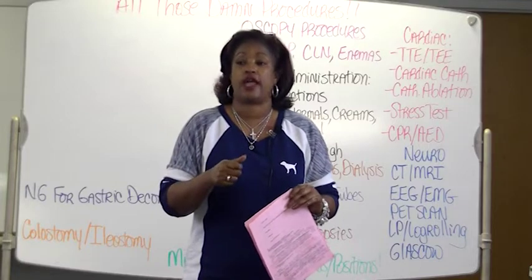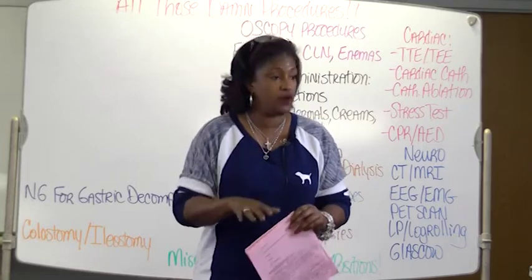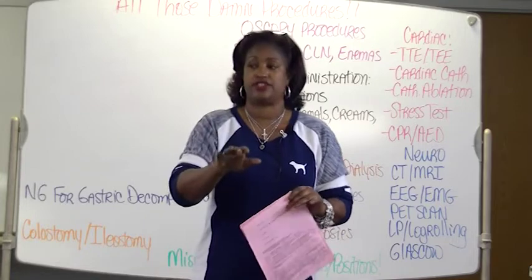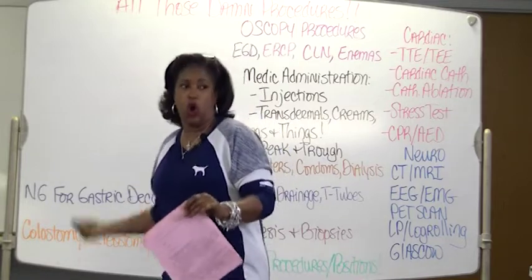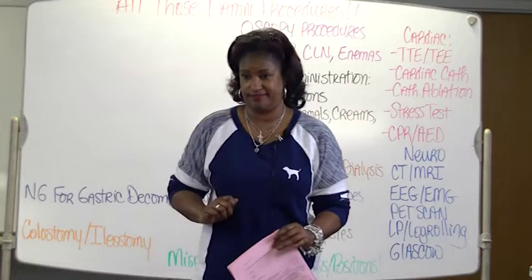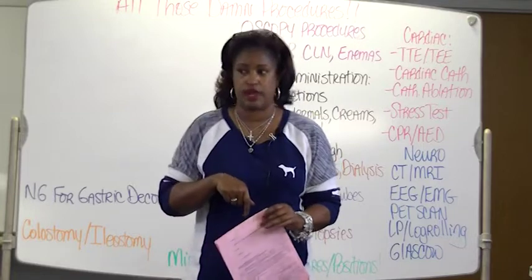And she says, okay, let's practice together. Okay, 1, 2, 3. I'm going to pull it out now. Start bearing down. And the patient starts, hold, hold, hold, hold. Because if they inhale, they just got an air embolism. Hold, a little longer, almost done. Come on, practice that with the patient.